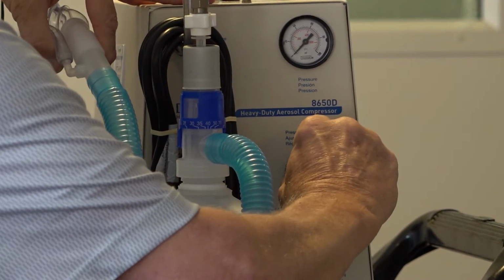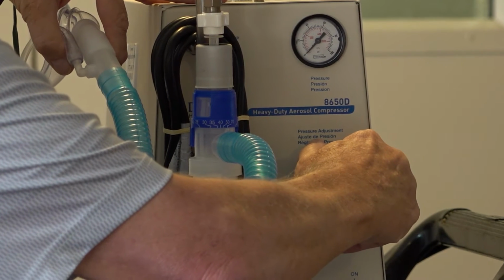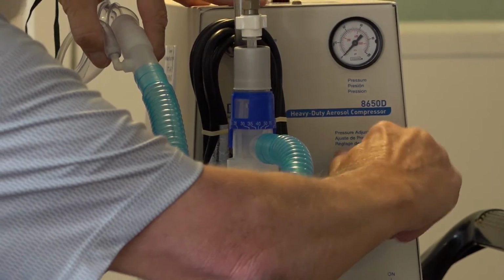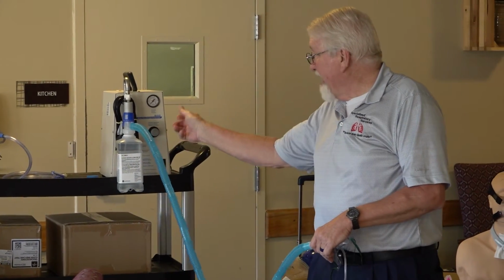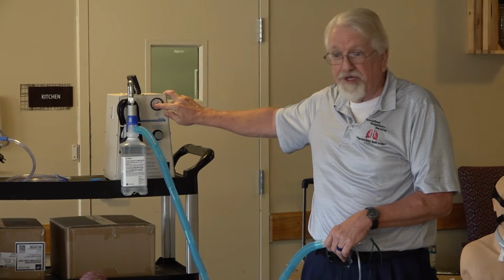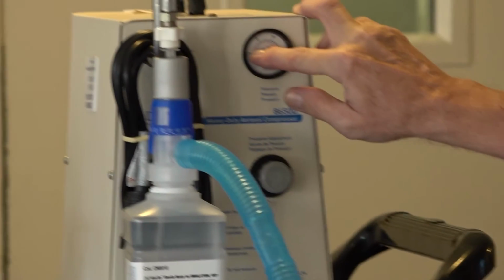You usually have to pull the knob out and then make your adjustment, and then you'll see the pressure dial move as well. Okay, so that's one thing. I have seen numerous folks just sit there, it ain't working. So pull it out and then adjust it, and this pressure manometer is going to indicate where you're at. Again, anywhere between 20 and 30 is typical.